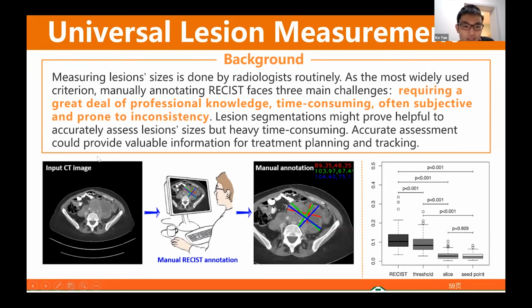But manual measurement of lesion size is very time-consuming and requires professional knowledge, and is also often subjective and prone to inconsistency. So Dr. Tang proposed several algorithms to automatically measure the lesions.